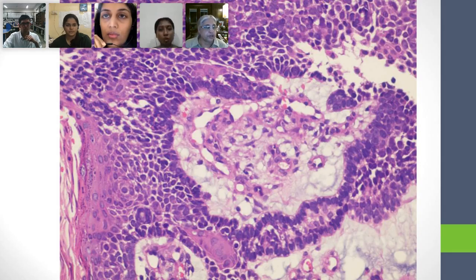No, it has got squamous islands over here. You can see a squamous island here. You can see a large area where this basaloid epithelium, they are all epithelial cells, is actually maturing towards squamous epithelium. You can even see keratohyalin granules over there. But this is not the basal type epithelium that you see in squamous epithelium. So what do you think it could possibly be?